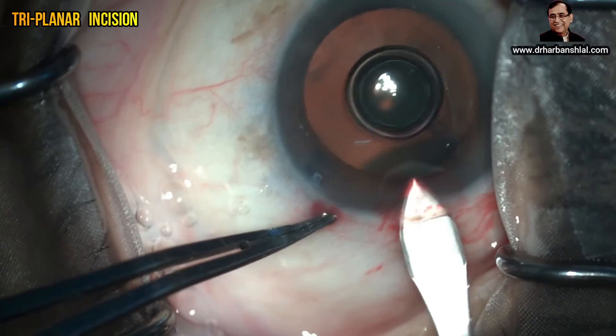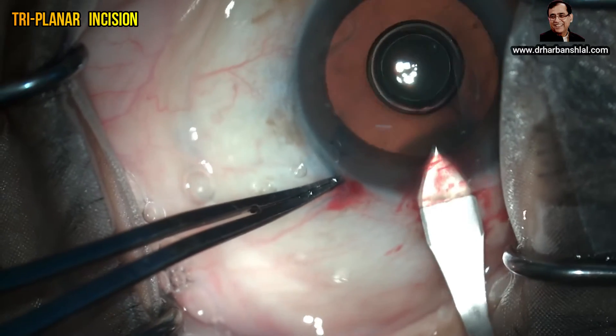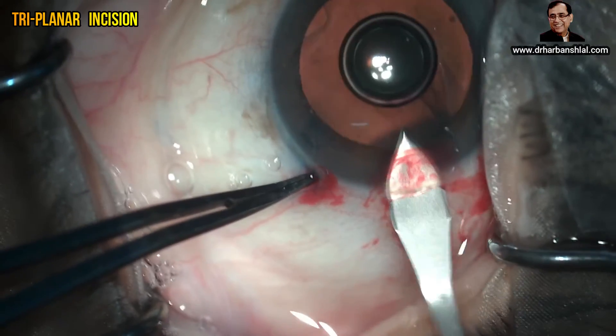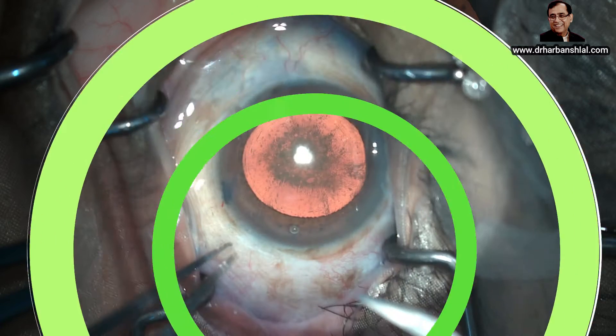Point the tip of the keratotome backwards to achieve perforation of the anterior chamber. Once perforation has been achieved, point the tip forwards toward the corneal dome to achieve the perfect inner line. You can see that this is an excellent incision, and the posterior lip is slightly white, which shows that the incision has been made at the limbus.